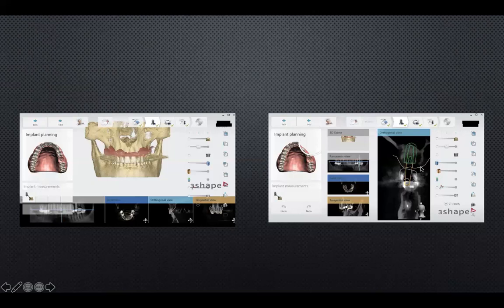And again, you design the implant so you have your access hole in the central fossa of your crown, and mesiodistally and facial-lingually it has to be within the bone envelope. At least you have to have 2 millimeters of bone surrounding it.